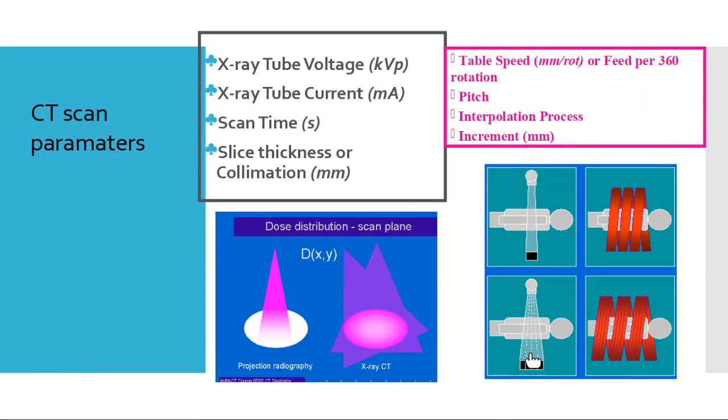It is important to note that the CT dose index was introduced in 1991, while CT was invented in 1971. So for 20 years we did not have those descriptors for CT scan. Still, we have a very serious shortage in the estimation of radiation dose based on those descriptors, CTDI, CTDI volume, and DLP, because the imaging protocol is quite different from conventional imaging.